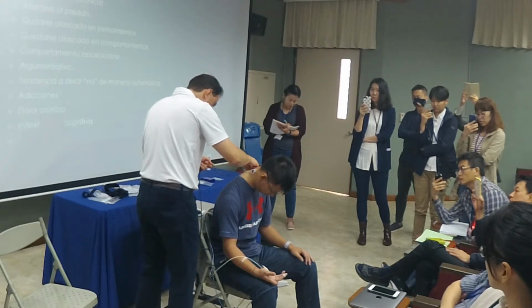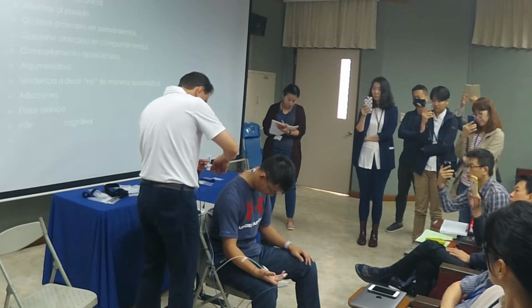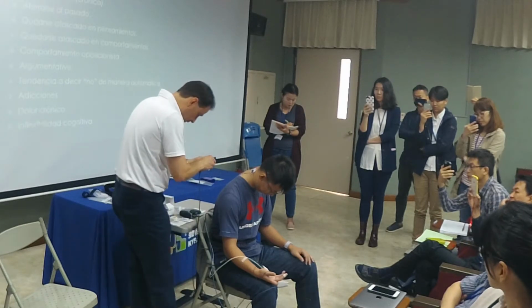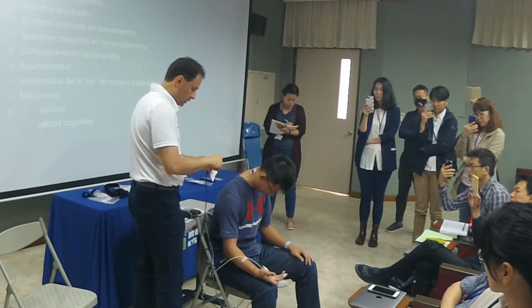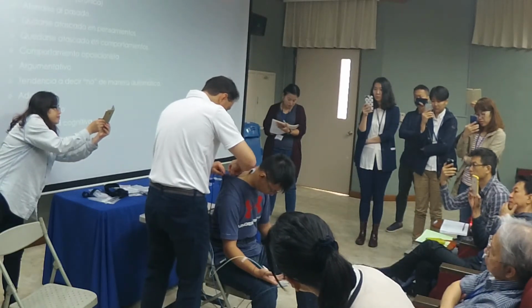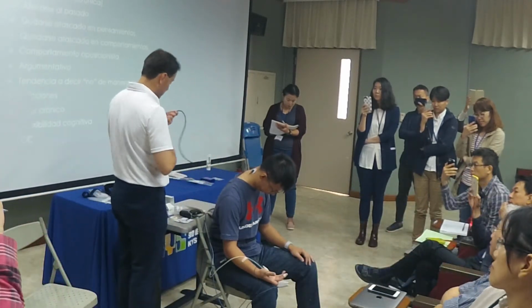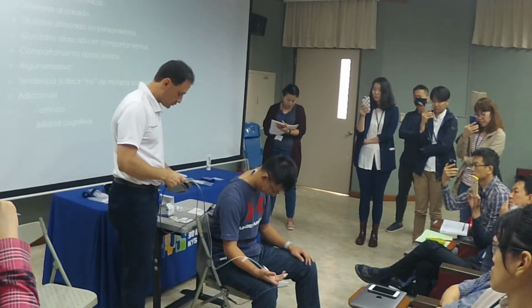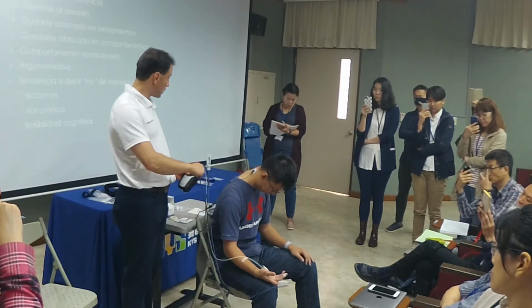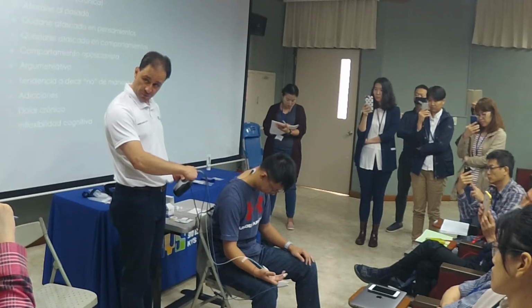Make sure that I'm not pulling the cable too aggressively. So you have to be very, very careful when you do this. And then with the black, we're going to go on the right. Okay, so that's it for this set. And this is going to go into channel B, which is the second one. If you make the mistake of putting it on channel 1, it's not going to record anything. That's for your neurofeedback. So this is for EMG, this is for neurofeedback.